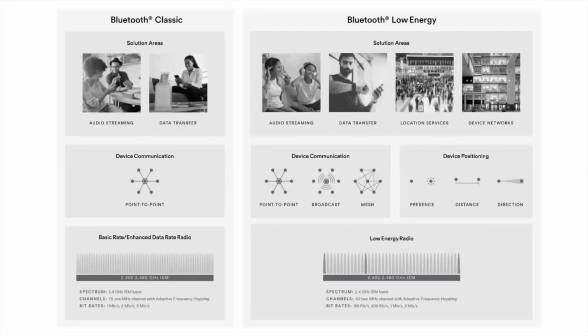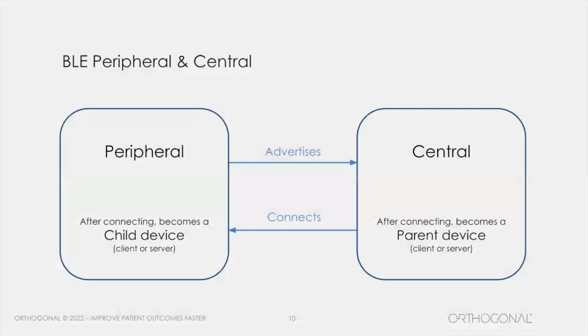Early on, I know we worked on somewhere we were using Bluetooth Classic, but it's been at least 8 years since we've done anything with Bluetooth Classic for medical devices. So when we get to Bluetooth Low Energy, or BLE, we have to think about the concept of peripheral and central.